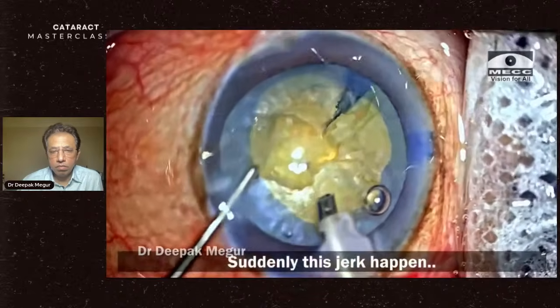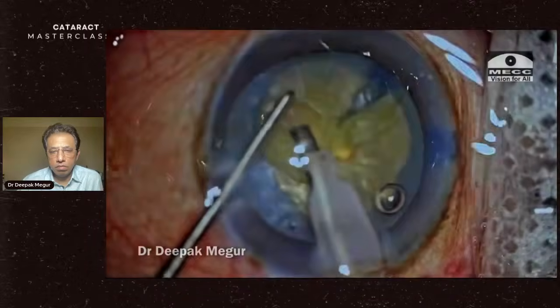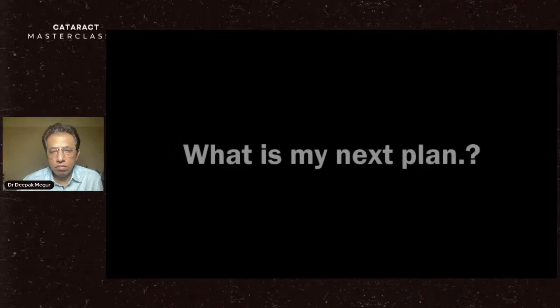Now, this is the third case, of phacoemulsification being performed. There's a momentary fluctuation in the anterior chamber. This sign alone should warn us about the possibility of an underlying posterior capsular tear.